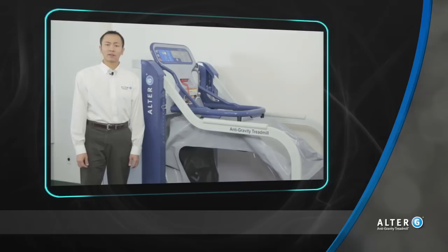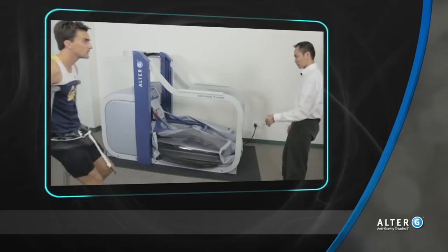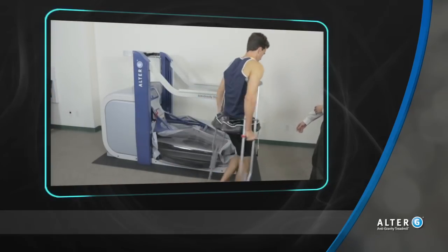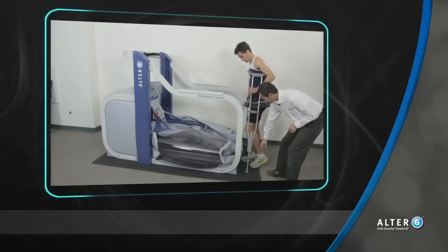Someone who is partial weight-bearing can really enjoy the Alter-G because it helps them improve their motion while protecting their healing tissue. With the ability to begin weight support from as low as 20 percent, most patients required to be toe-touch weight-bearing can now be confident they are following their physician's instructions.